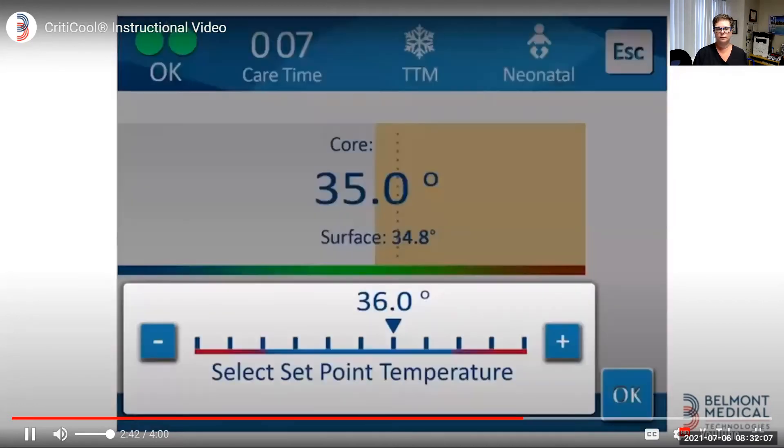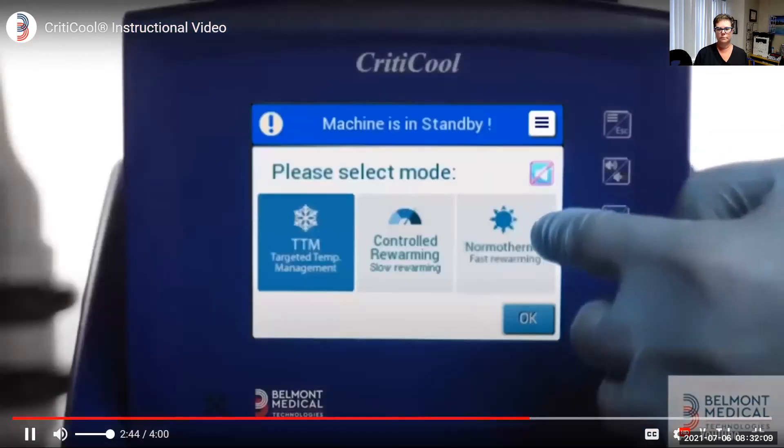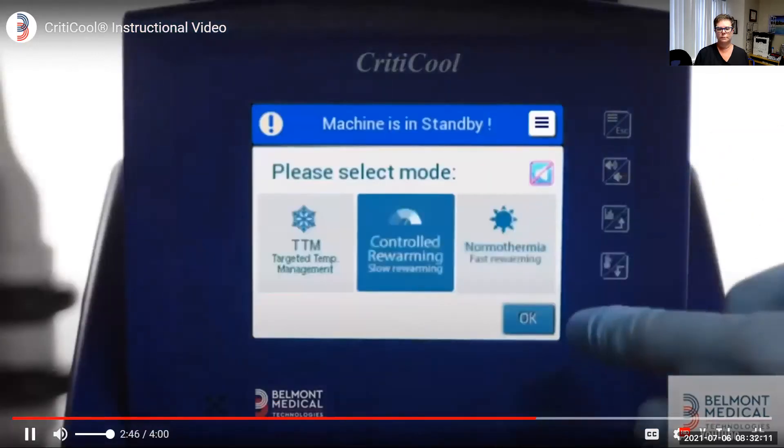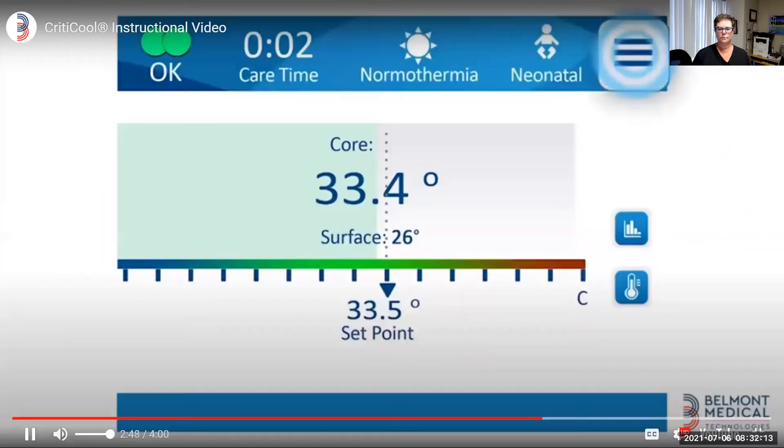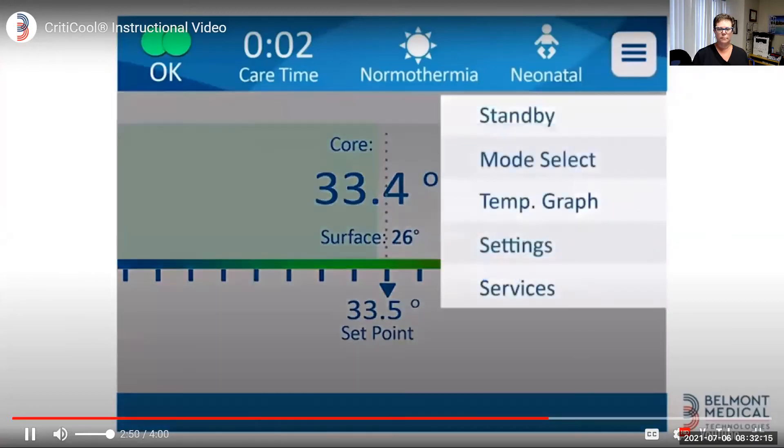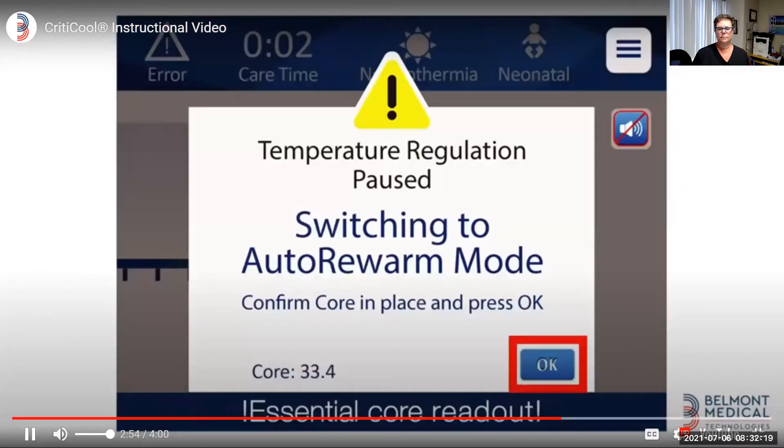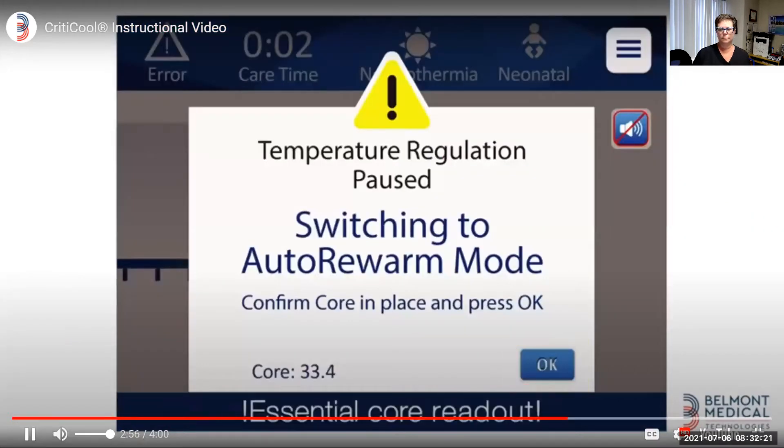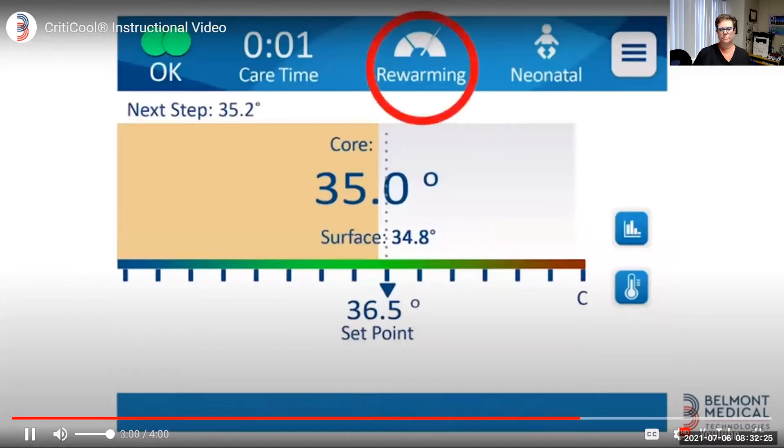The system is designed to maintain the set temperature for as long as needed. The system also offers protocols for controlled rewarming and normothermia. Touch the menu icon and in the mode select option, touch the controlled rewarming. A confirmation to the core readout temperature is essential to activate the rewarming mode. Once accepting the change, the status will be changed and you will be able to see that you are in rewarming mode.